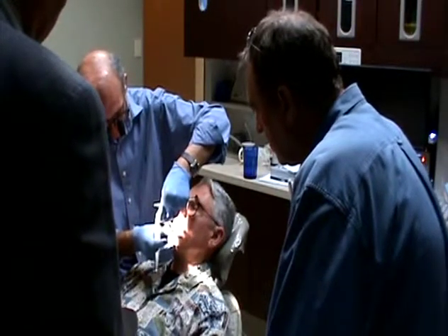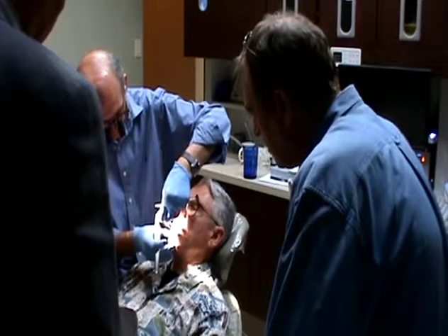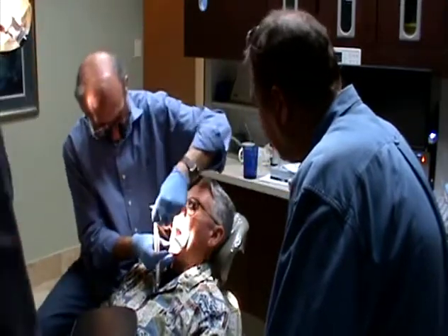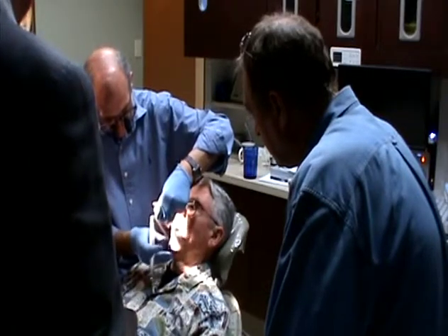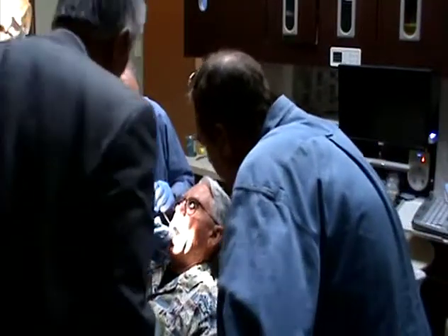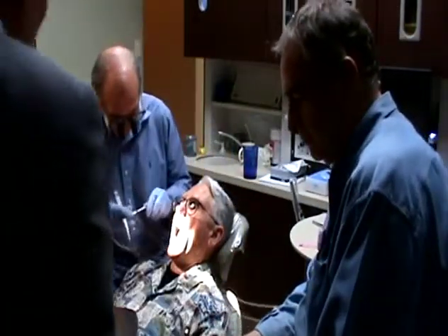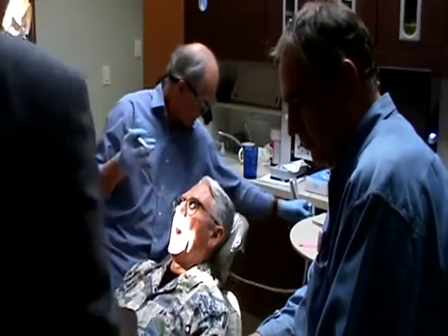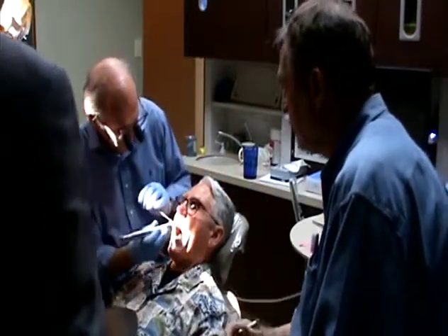Slide your jaw to the right, back to the middle, slide left, back to the middle, open. Open. It looked like it was just saliva rather than a mark.